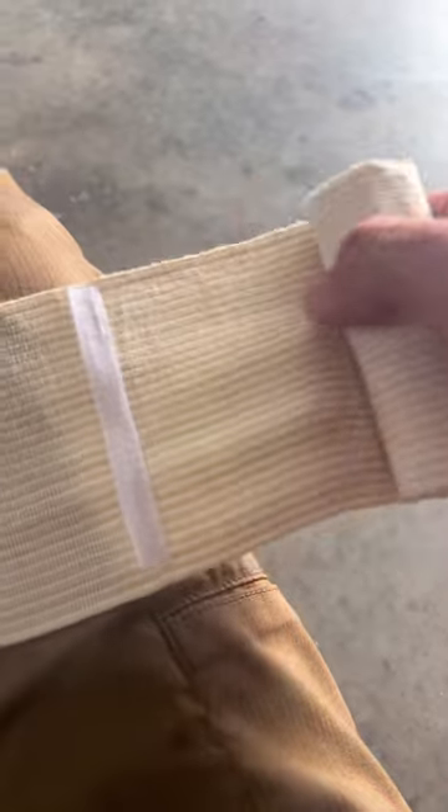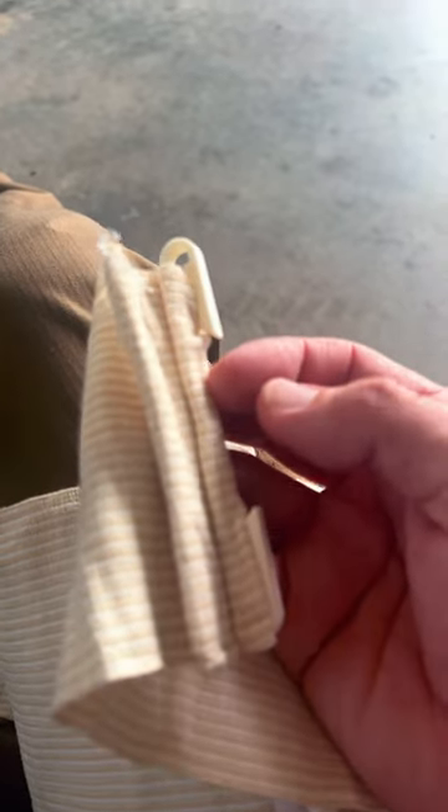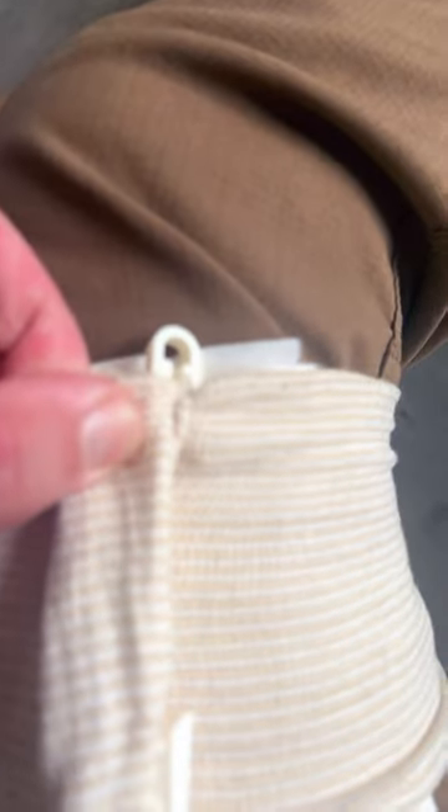It has these little velcro clips that are going to stop it from unwinding too much, and also has a clip at the end to hold it in place. Once you get it wrapped around, you should secure it in place.